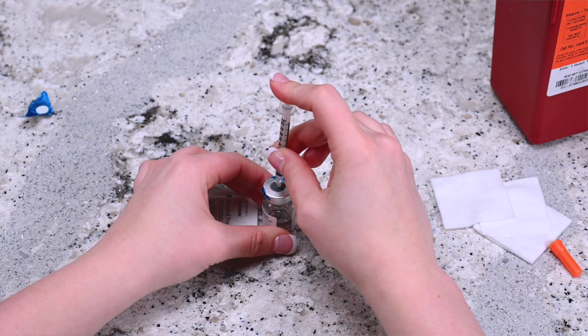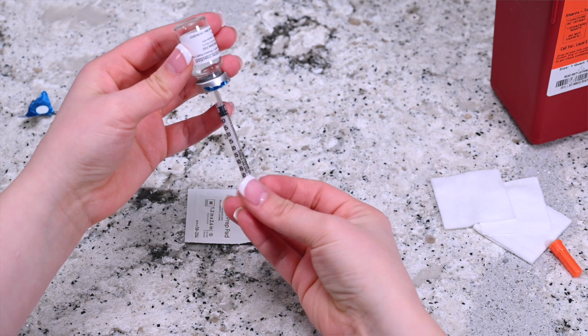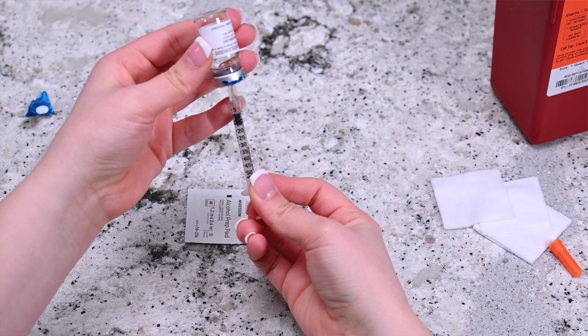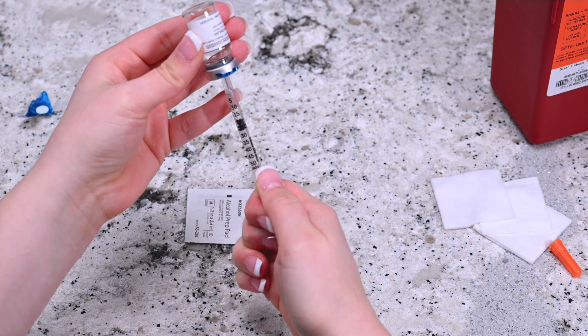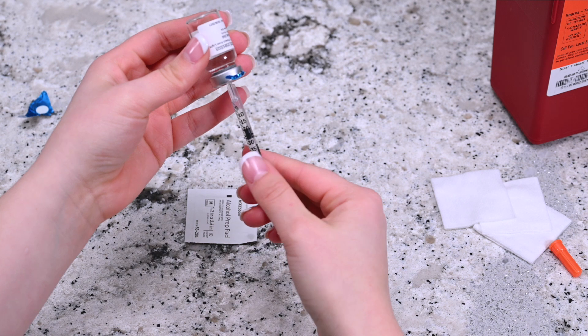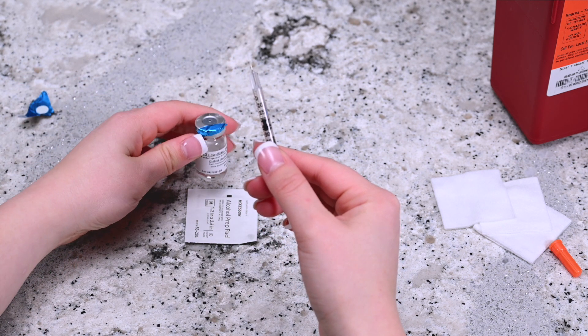Invert the vial with the needle and syringe attached and pull the plunger, keeping the tip of the needle submerged. When the plunger is filled with the correct dosage, remove the needle from the vial holding it upright. Do not let the needle touch anything, including your hands.